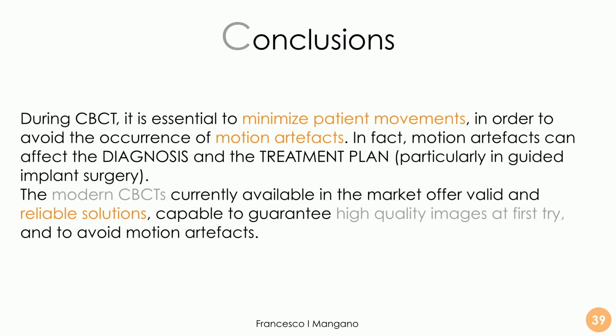And modern computed tomography systems help us a lot, because they offer different valid and reliable solutions. For example, with the CS9600, the patient can stand, or if the patient is old, for example, he can sit.